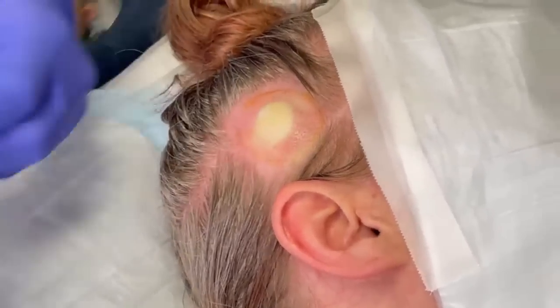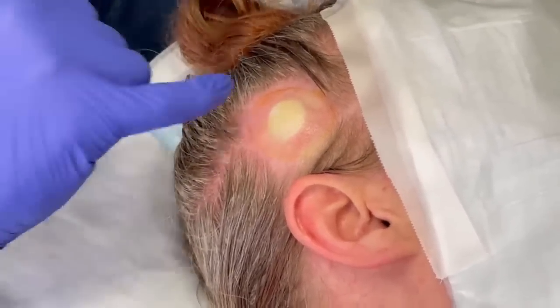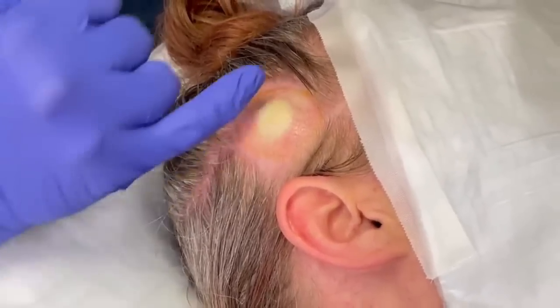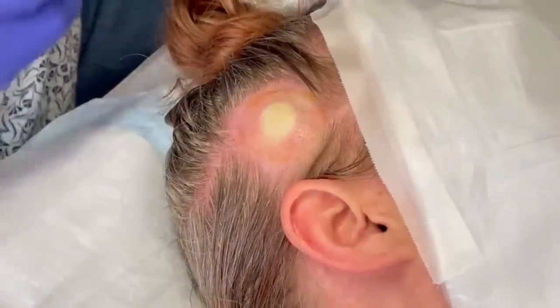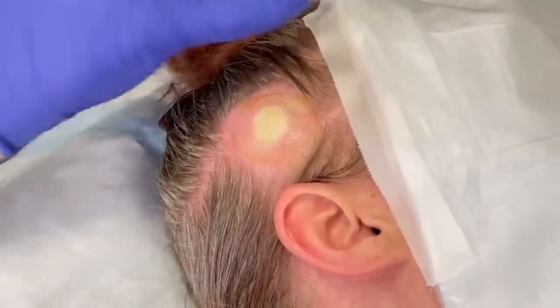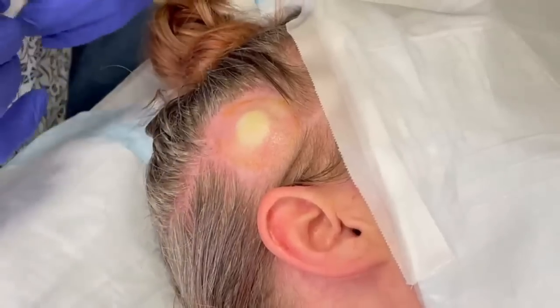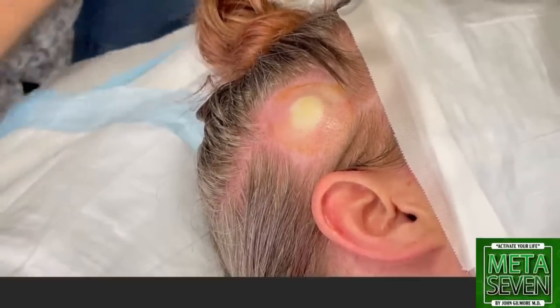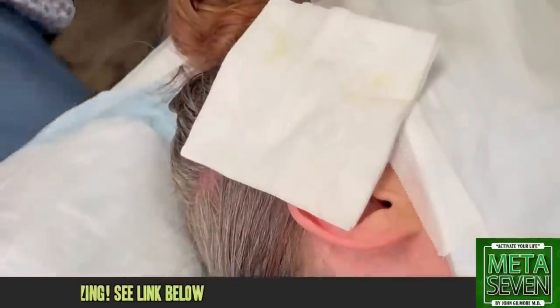I'm so excited. Do you want the incision to be up and down, north and south, or east and west? I was thinking eye to ear kind of direction. Kind of diagonal. Diagonal, yeah, I think that would be good. All right, let's give it a few minutes, okay? I'm going to just put this right there.